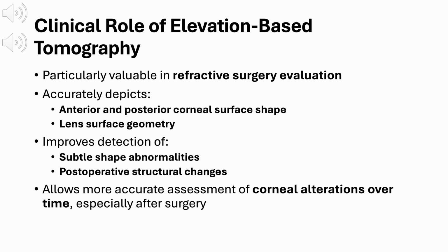Because elevation maps are based on actual spatial position rather than averaged curvature, they improve our ability to detect subtle shape abnormalities. That includes very early ectatic changes, as well as small but meaningful postoperative structural changes that might be missed on axial maps. Finally, elevation-based tomography allows more accurate longitudinal follow-up. When we're comparing scans over time, especially after refractive surgery, elevation data is better suited to detecting true corneal alterations rather than changes caused by smoothing, scaling, or reference axis assumptions. This makes it a powerful tool for both preoperative screening and postoperative monitoring.